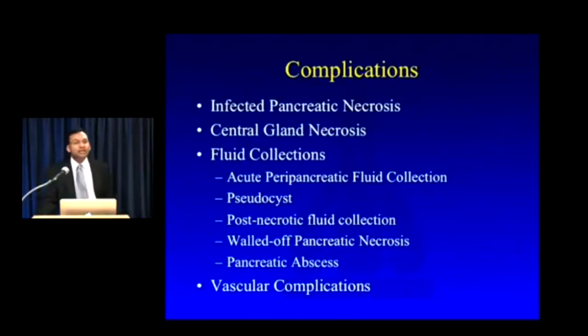Now, once you've made the diagnosis of acute pancreatitis, and you've determined whether or not it's edematous pancreatitis or necrotizing pancreatitis, your job isn't done. You've just moved on to the second step. And the second step is to identify a number of common complications that I think are critical to be able to identify and that may have implications in terms of treatment.